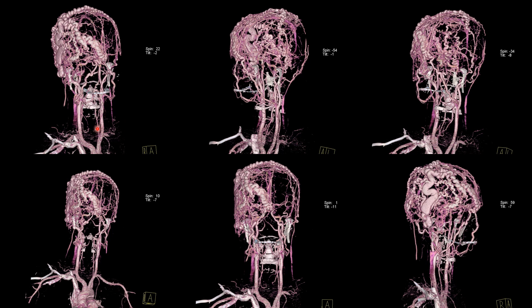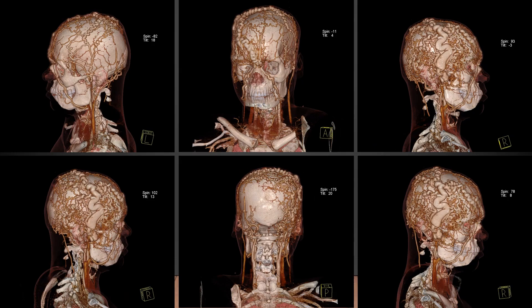These are the volumetric reconstructions of the CT angiography. Here we can see there are multiple, in fact hugely dilated and tortuous scalp veins. In this particular image we can see the arch of the aorta with its branches. This is yet another reconstruction of the CT angiography, showing huge dilatation of a scalp vein.